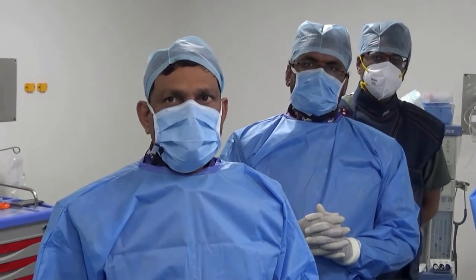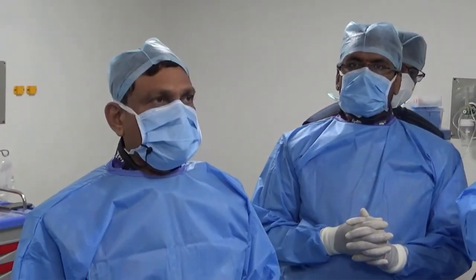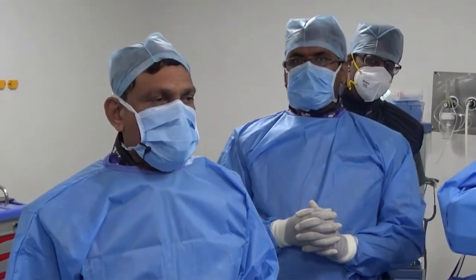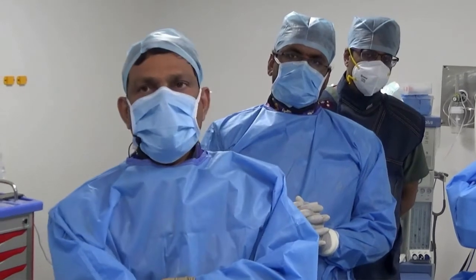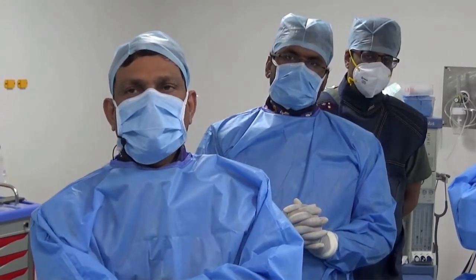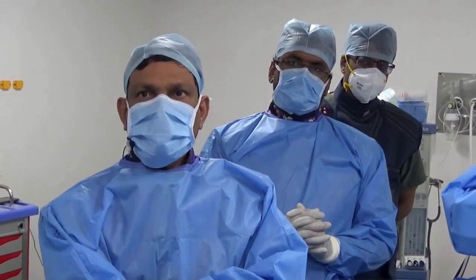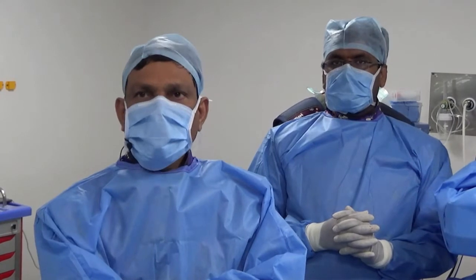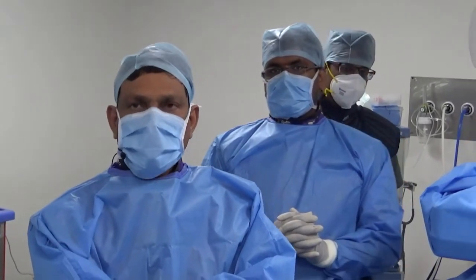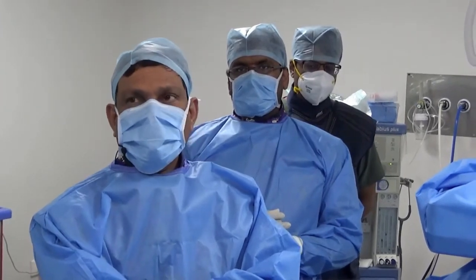Please. Yeah, the only comment I wanted to make is that when you close these distal fistulae with such dilated proximal tracts, with the vessels' branches being given right up to the end, be careful about slow flow and no flow following plugging of these distal holes. You may get into serious problems sometimes. So you have to be careful that you don't cause this kind of a complication. I will definitely take your point, sir.